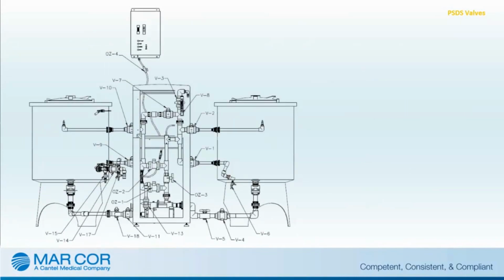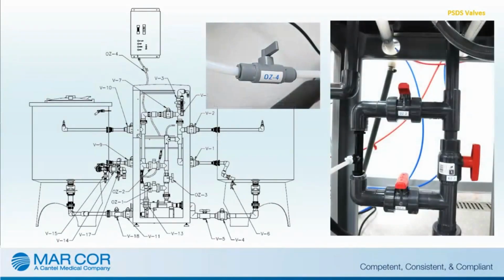Note, the PSDS with the optional O3Z ozone disinfection system incorporates 4 added valves specific to the optional ozone disinfection system. Make sure that valve OZ3 remains in the open position and OZ1, OZ2, and OZ4 remain in the closed positions at all times except when operating the O3Z ozone generator.